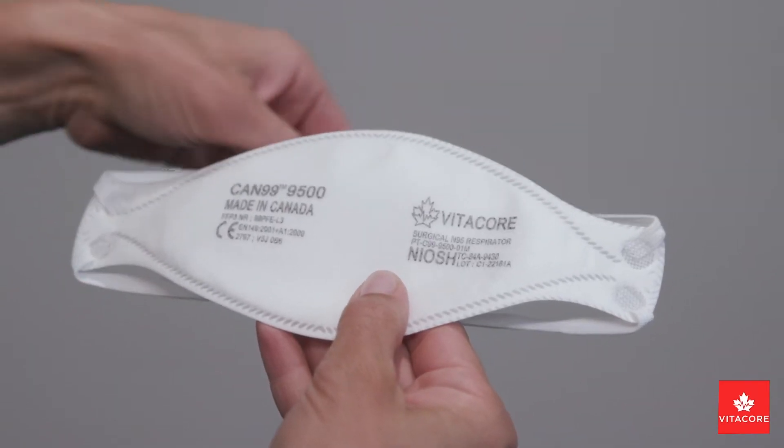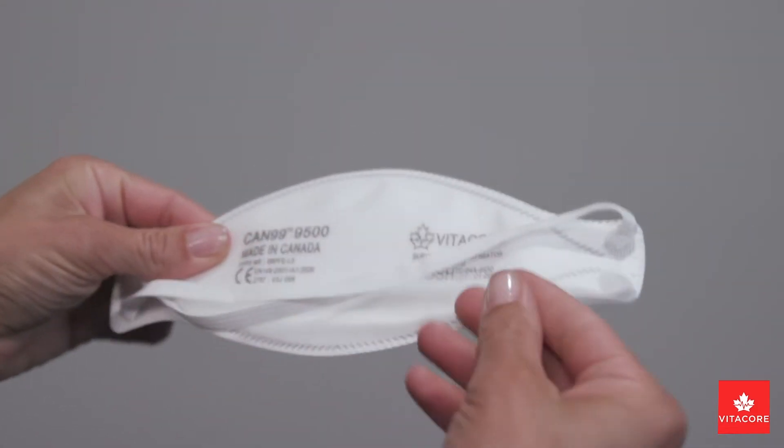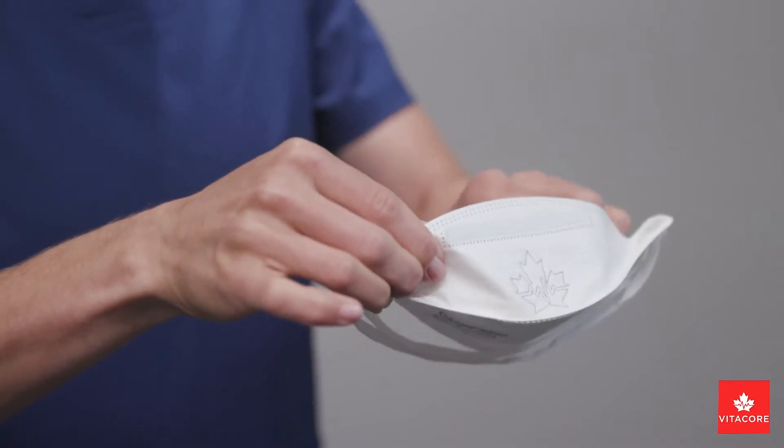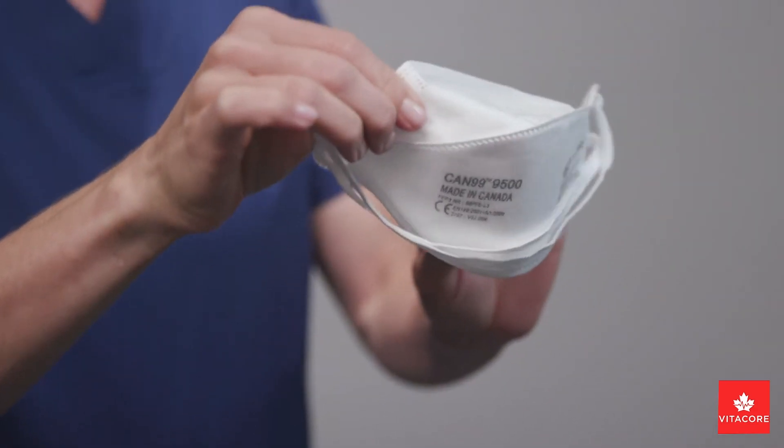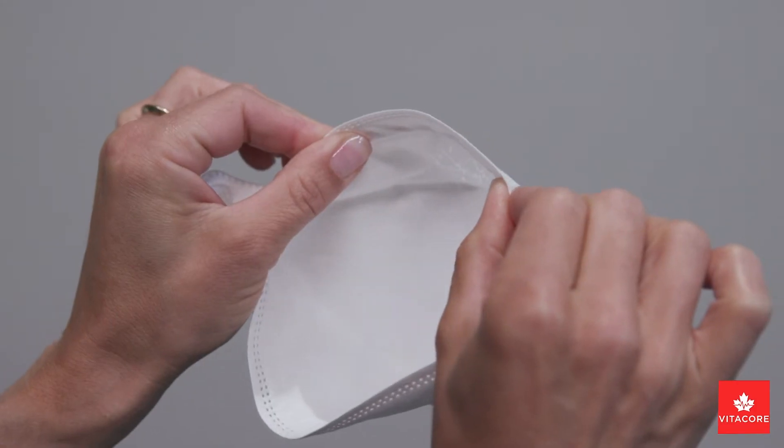When donning your mask, remove the VitaCore CAN99 respirator from its packaging, positioning both straps in the front of the mask. Fully open the top and bottom panels, gently bending the nose piece to form a round arch.